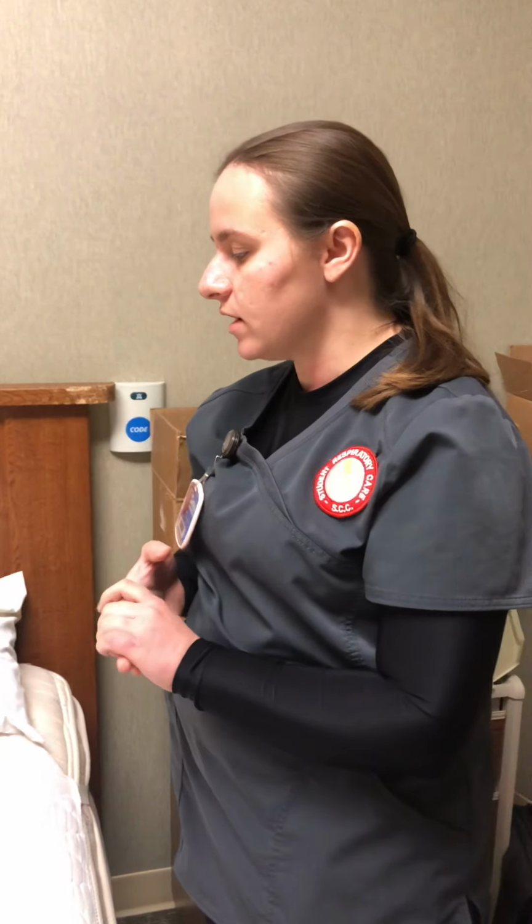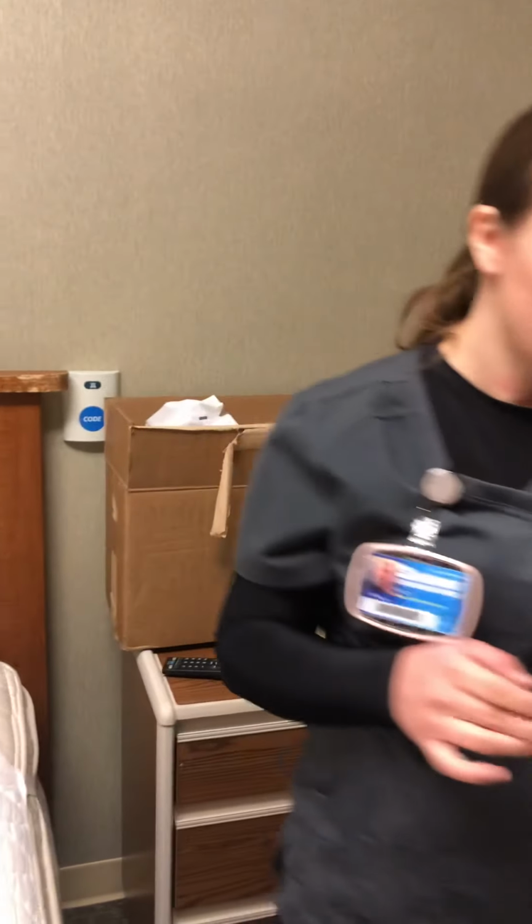And so I'd check the vital signs after to make sure the levels are starting to level back out with the oxygen on. So I'll come back after a bit here and check on the patient. So I left the room for a little bit, and I was notified that our doctor said that after a few days he would like them to start being weaned off, and he wants them to go down to 4 liters per minute.